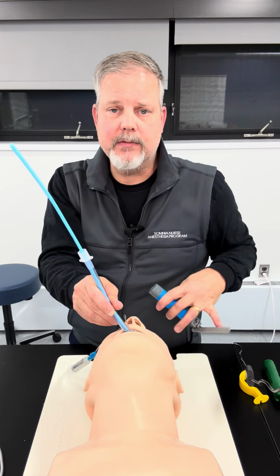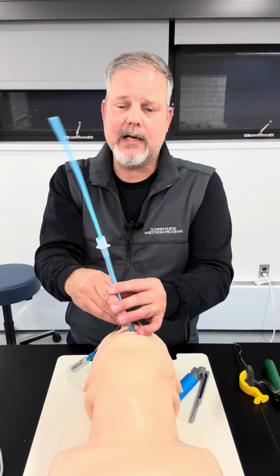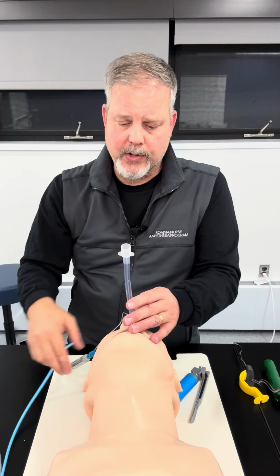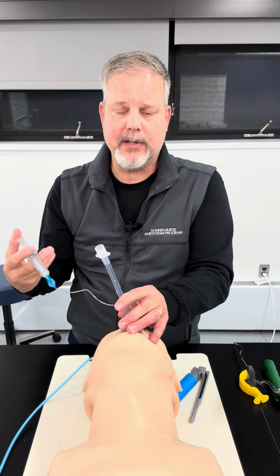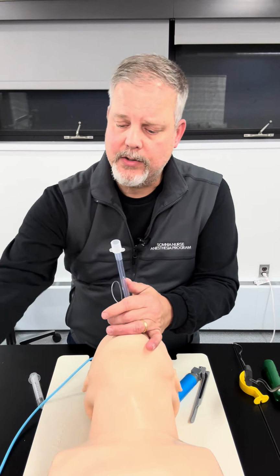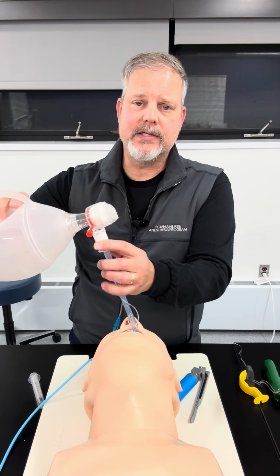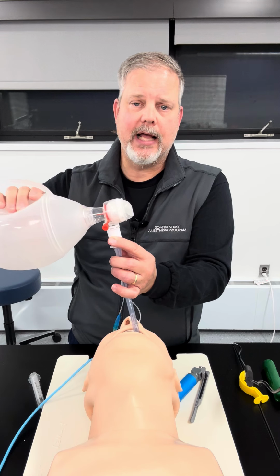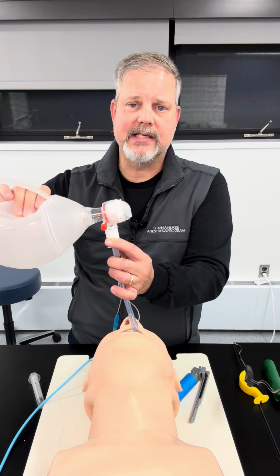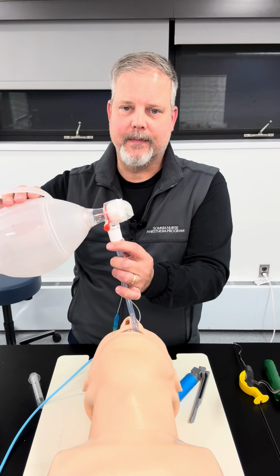Once you have seen it visually go through the cords, then you're going to pull your blade out. You're going to have the bougie pulled out at this point in time. You're now going to inflate your pilot balloon and your cuff, and then connect your circuit and squeeze your reservoir bag to see that you now have inflation of your lungs, to know that you've had successful placement of the endotracheal tube using the bougie.